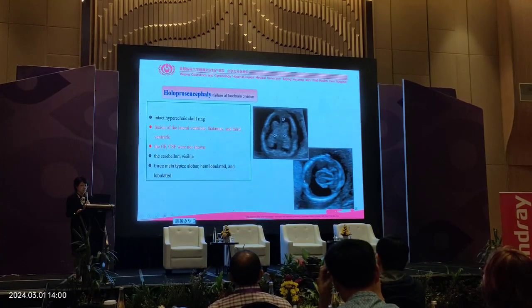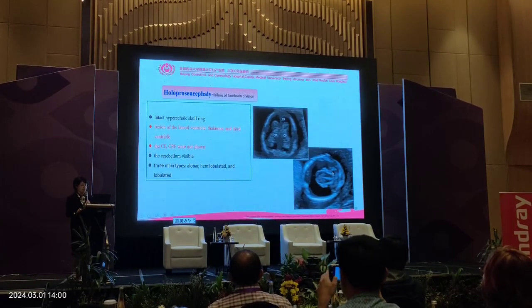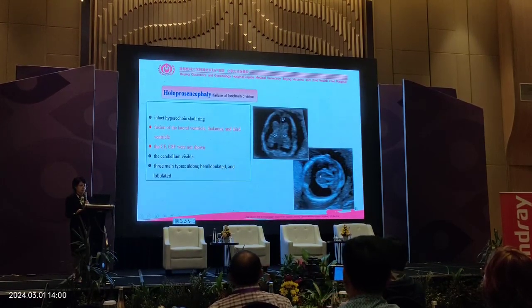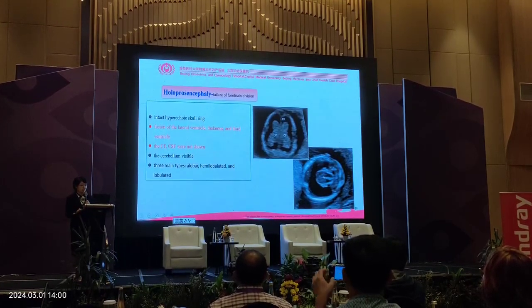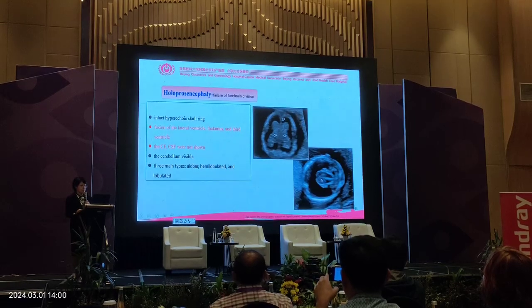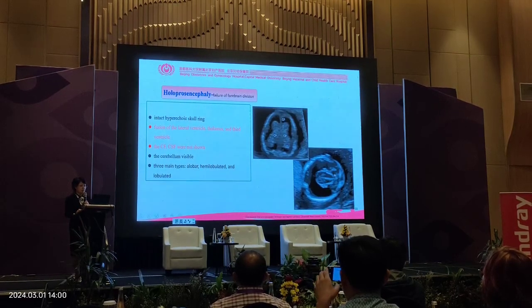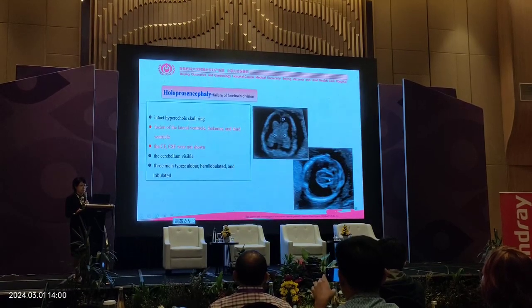It's holoprosencephaly, with fusion of the lateral ventricles, thalami, and the third ventricle. The CSP would not show, but the cerebellum can be visible in this section.